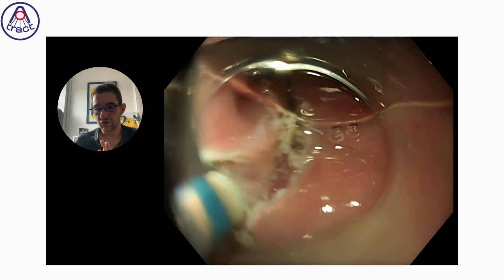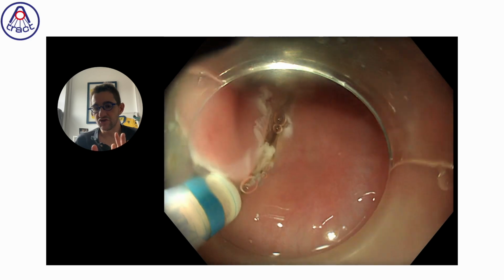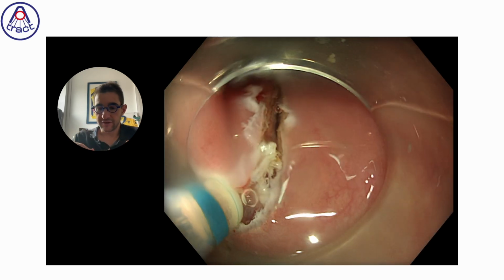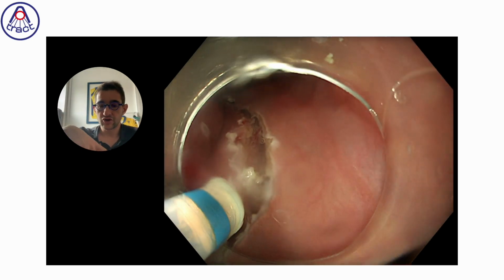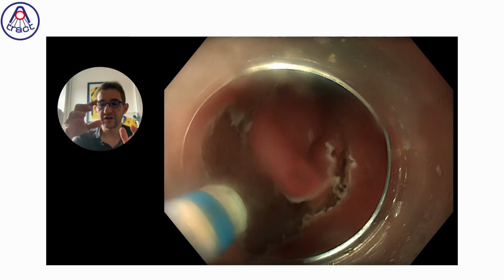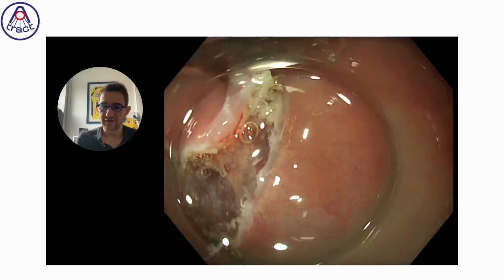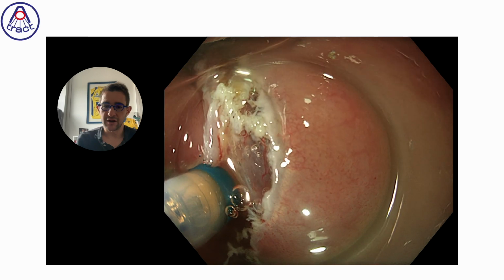So a good way to avoid doing not enough incision when you try to reach another incision is to do incision and then trimming in the same movement. So you are sure that you do a complete movement of incision and not only one part. So I don't know exactly, but possibly we will change again. I will see it.